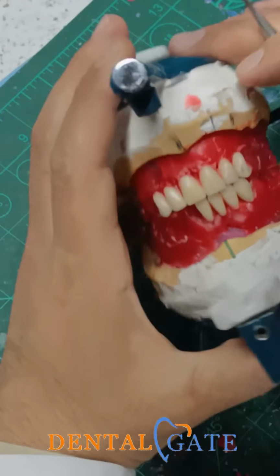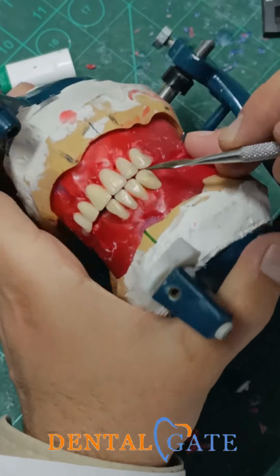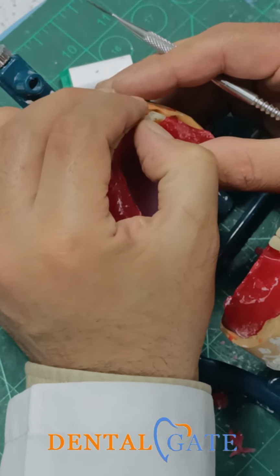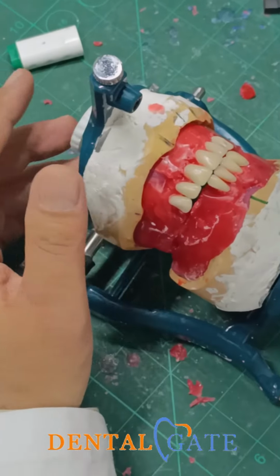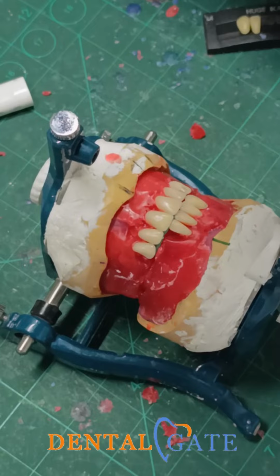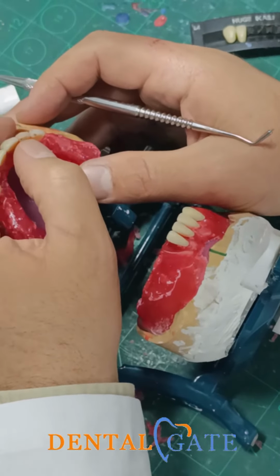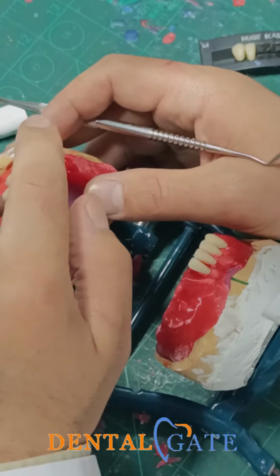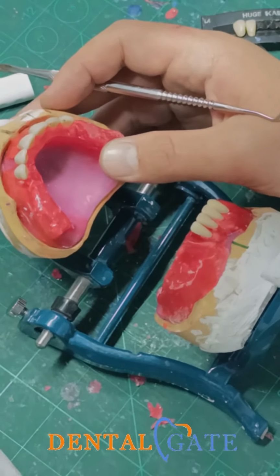Now, make a double check of the overjet and the overbite. You can see this is the 1 millimeter, this is the 1 millimeter. This is my mistake in the upper. Just push it because I had a severe curve here. You can see you can make a correction to the upper. It is not your fault. You can make it because I need to find a result. But when I push and correct my curvature, it is with the same rules, the same space, just altering the curve to compensate, to make a match with the lower. Okay?